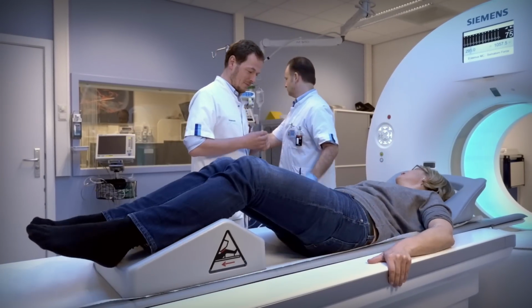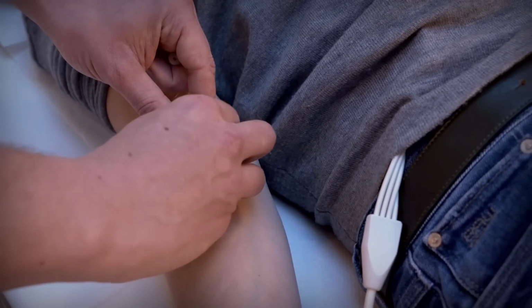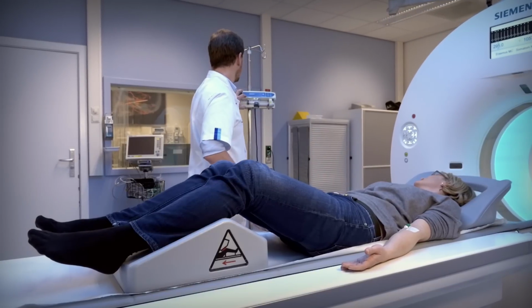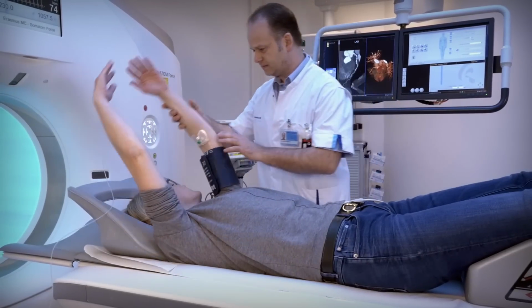Adenosine will be given as a stress agent. The effects of this agent may be warm sensation and some pressure on the chest. If we inform the patients beforehand about these sensations, the patient will be more relaxed and will be better able to cooperate during the examination.